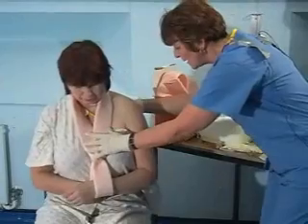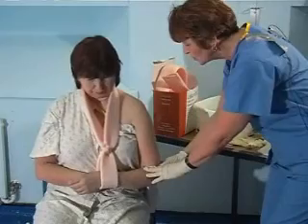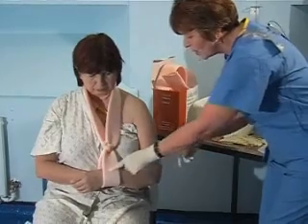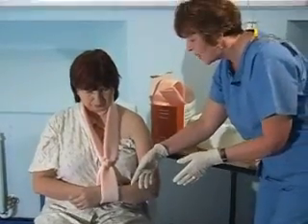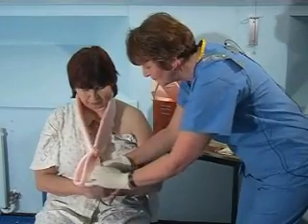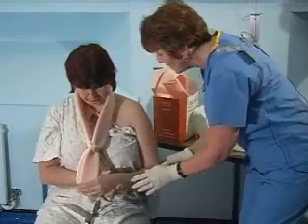We sit the patient forward and look at the gravity of the arm. Now if we see that the bone looks almost straight — which these fractures are very unstable anyway — but if we can almost get it straight, then we know this level of the collar and cuff will be fine. Otherwise we take it down a bit lower. Now we take the arm out and Teresa can rest her thumb in the collar and cuff like that.